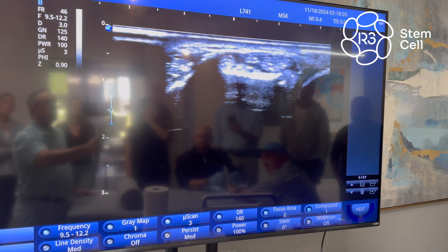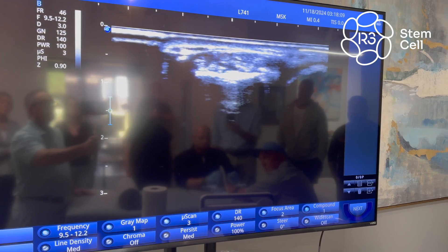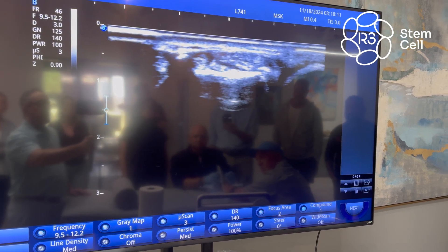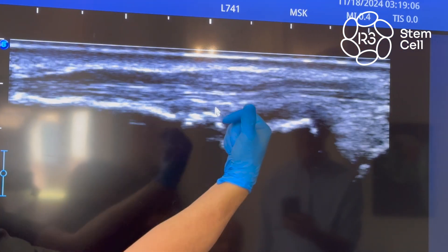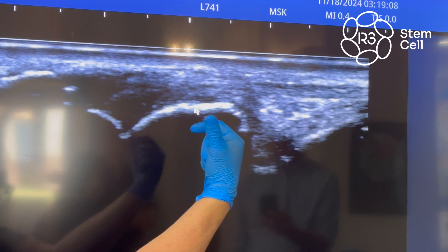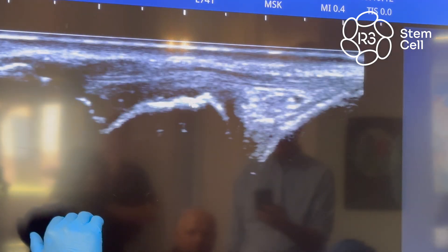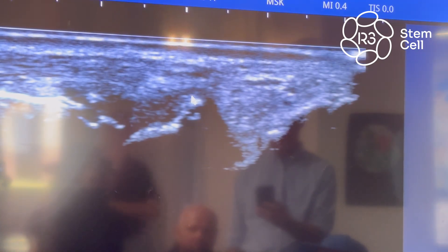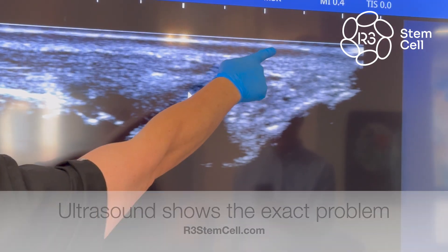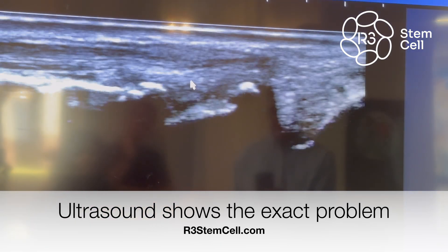As long as you know which direction you're facing, it doesn't matter — but you have to know where you are. There's a calcific outgrowth right here. Bring it distal and bring it towards his thumb just a little bit. Yes, coming down into here, coming back, coming down into here — that's going to be your injection spot.